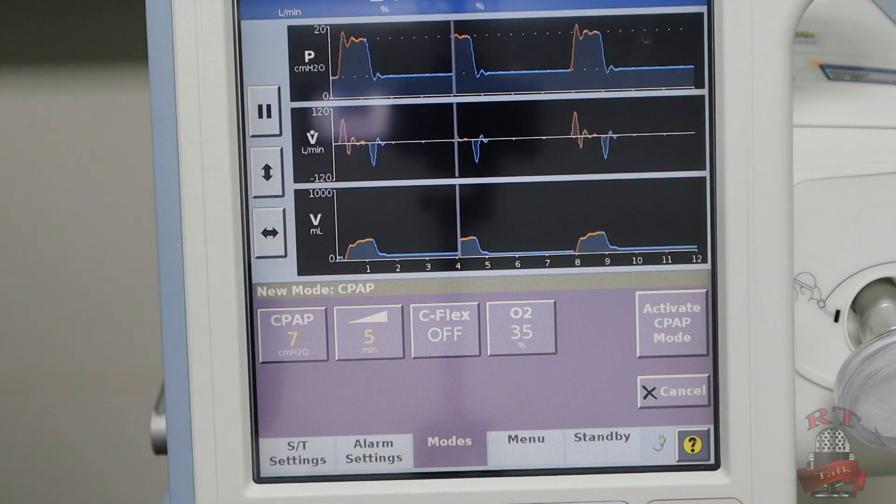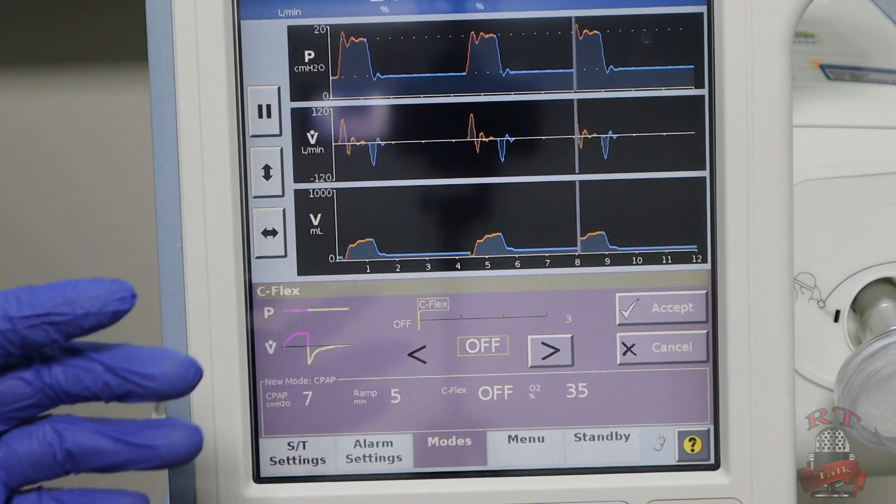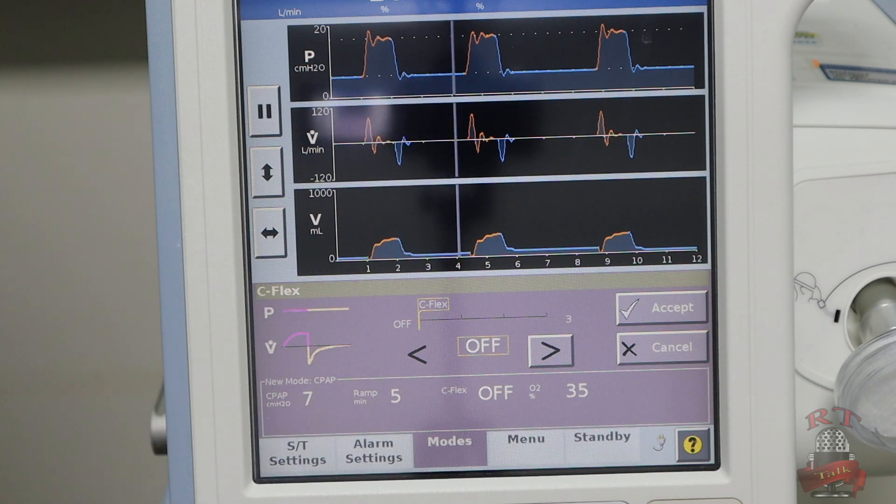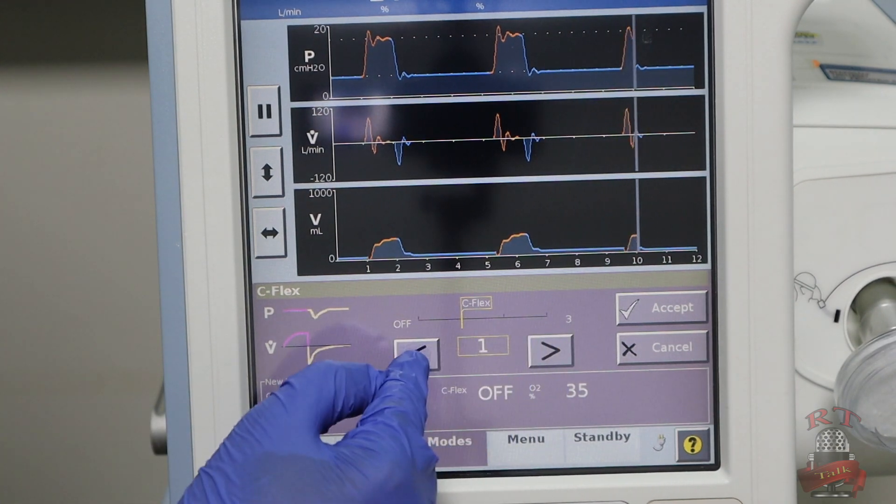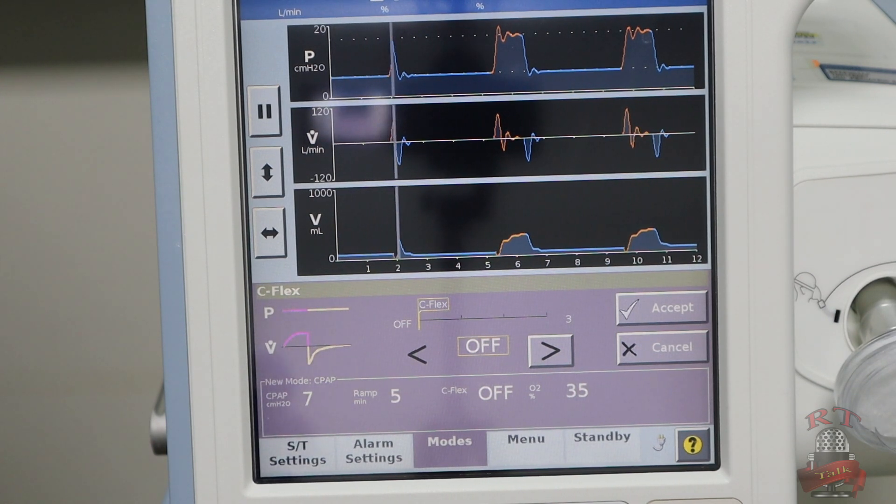Then the C-flex. If your patient is acute and you just want to start your CPAP with him, you will keep it off. If your patient is chronic, like with obstructive sleep apnea, the C-flex will let him be a little bit more comfortable with the CPAP. How it works?